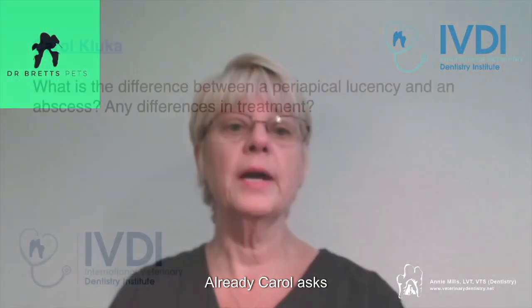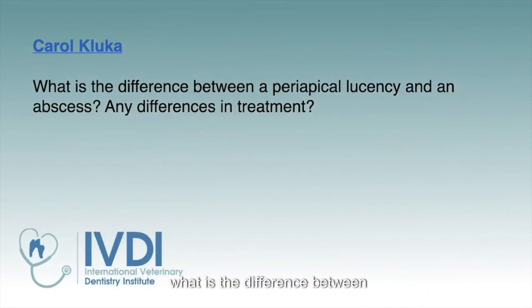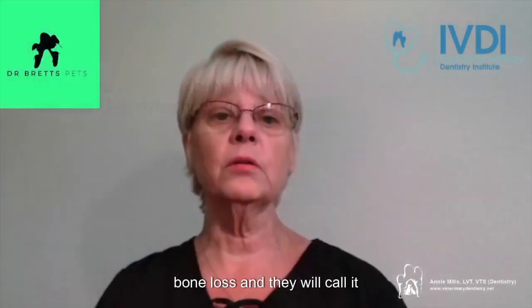Carol asks, what is the difference between a periapical lucency and an abscess? And are there differences in treatment? Excellent question. I'm glad you asked this because a lot of folks will see that bone loss and call it a periapical abscess.